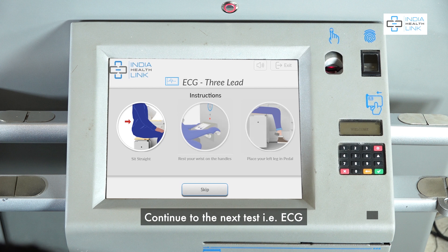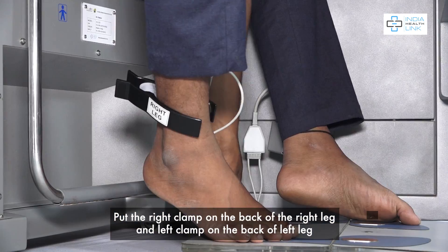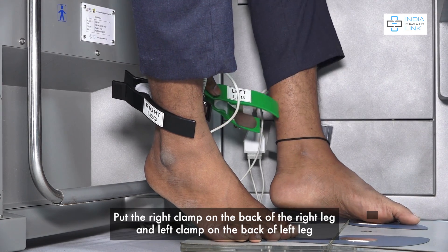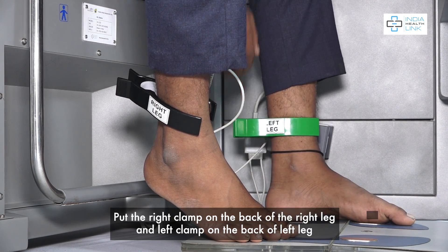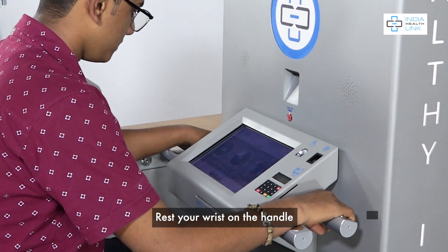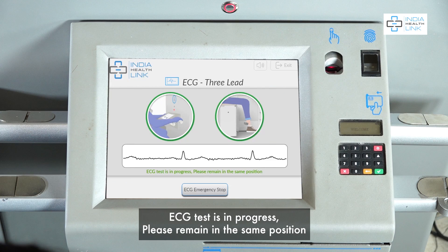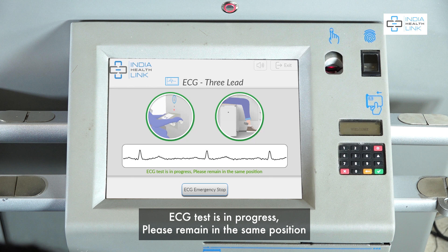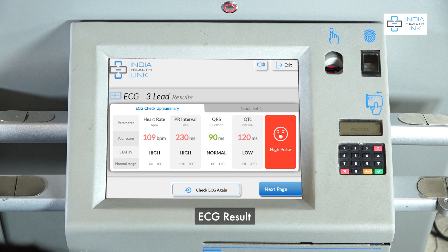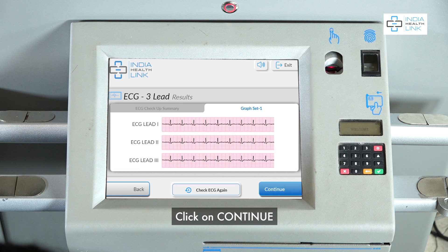The next test is ECG. Sit straight. Put the right clamp on the back of the right leg, and the left clamp on the back of the left leg. Rest your wrist on the handle. ECG test is in progress — please remain in the same position. View ECG result and click on Continue.